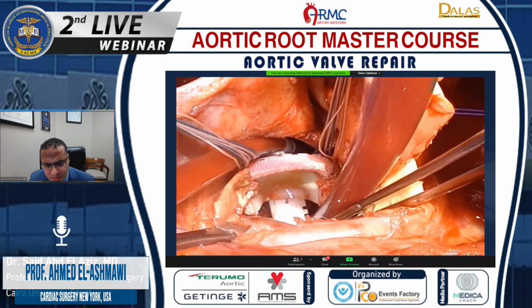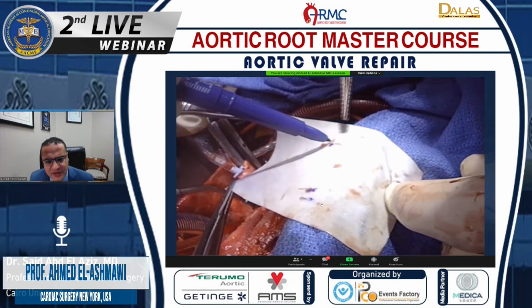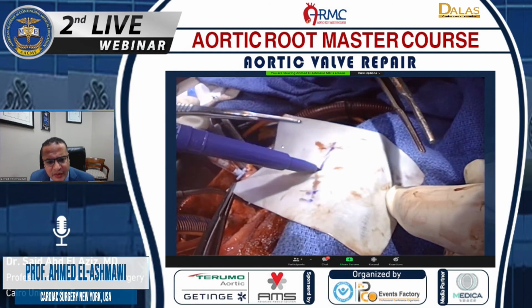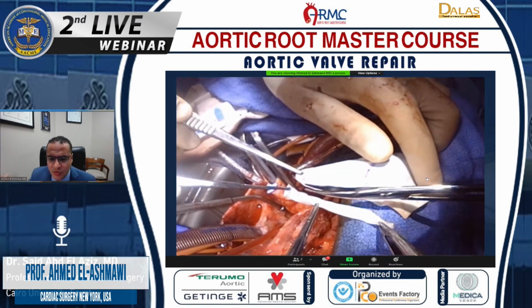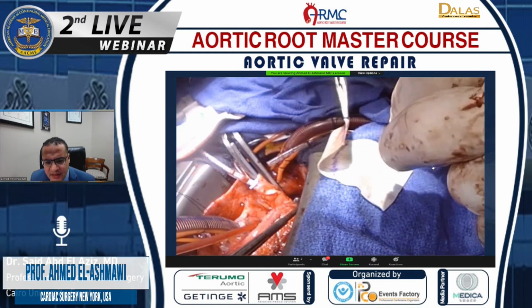We then reconstruct the curtain by measuring the intertrigonal distance. You add a few millimeters on both sides to compensate for the suture line, and that will be our new trigone. It's usually an oval-shaped patch. The posterior part of it will be used to reconstruct the dome of the left atrium, and the rest will be taken out to the aortic root. The patch is folded, and then it is lowered down.